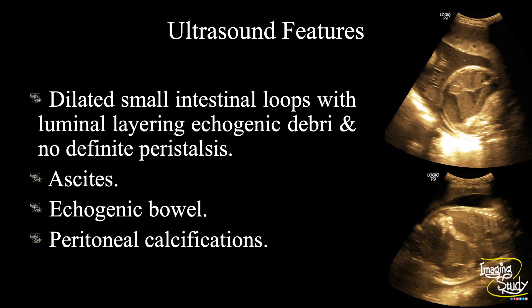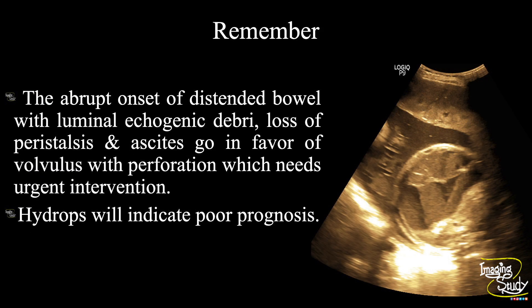In summary, we have seen dilated small intestinal loops with luminal layering echogenic debris and no definite peristalsis. We have seen peritoneal collection (ascites), echogenic bowel, and peritoneal calcifications. The overall features suggest meconium peritonitis due to bowel perforation.